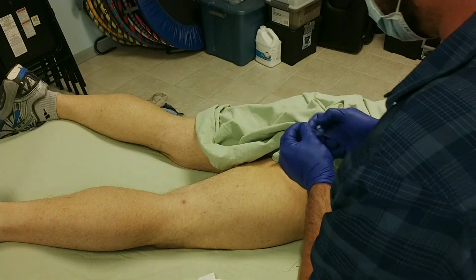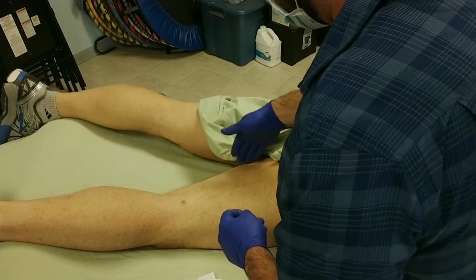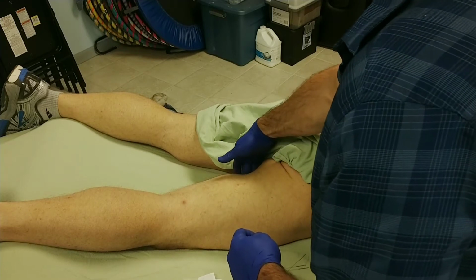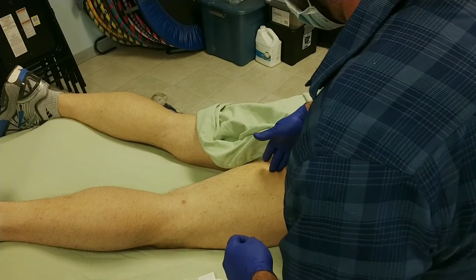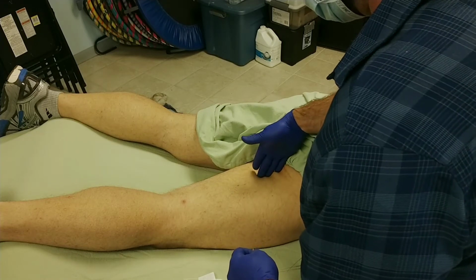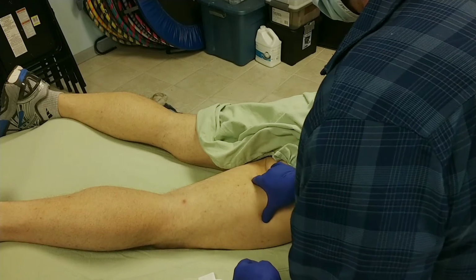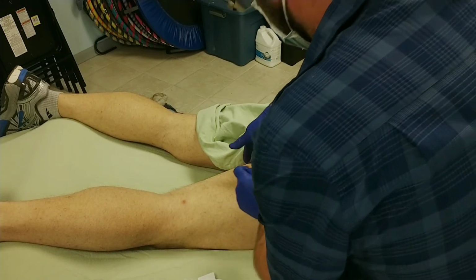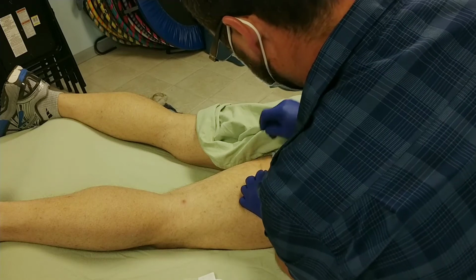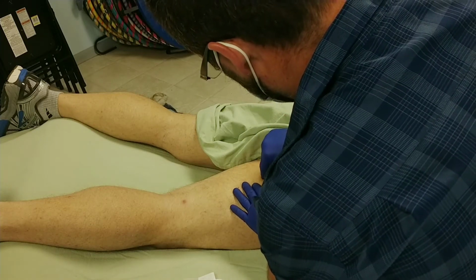The semitendinosus and semimembranosus aren't hard to find, but people often fall off and they're over here where we were for adductor magnus. So we want to realize they're not super medial in this proximal portion, they're more midline. So right in here is more where we want to be feeling for tender bits. Yeah, there's a good one there. So I'm going to aim just slightly away from the midline of the leg towards the midline of the whole body.